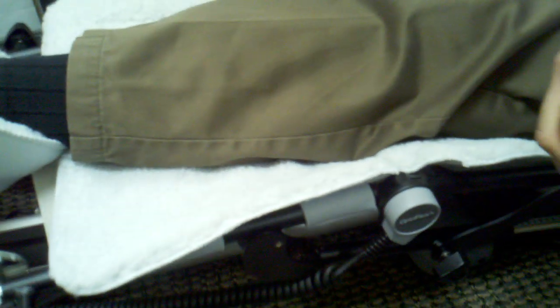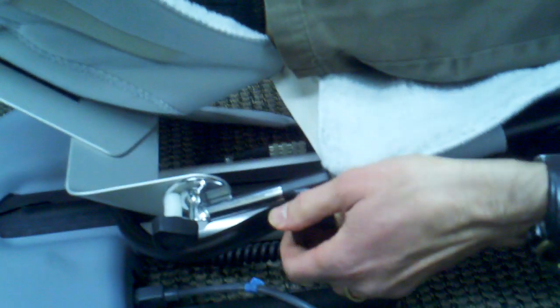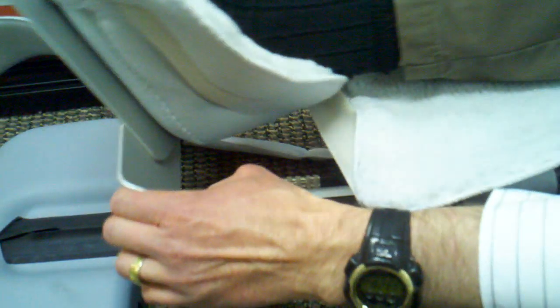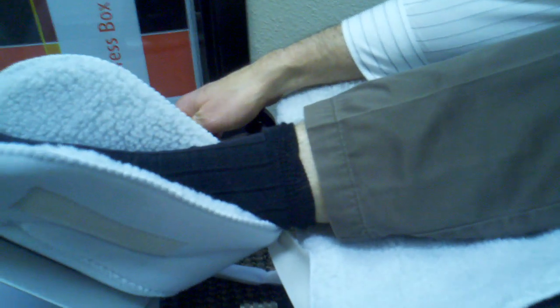You can see it's moving — and it's very quiet. You can adjust the angle so that the knee joint is at the center with these two knobs down here. You can adjust the angle of the foot with this knob here and the knob to the side, so you can bring the foot up into more dorsiflexion or allow it to go down into more plantar flexion.